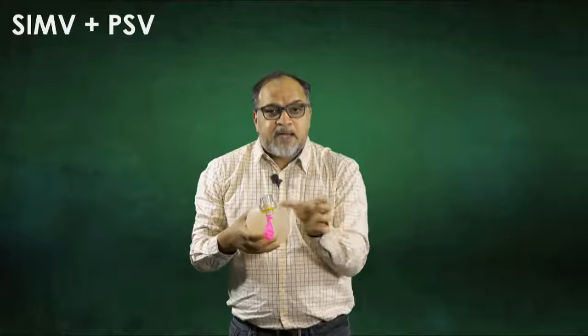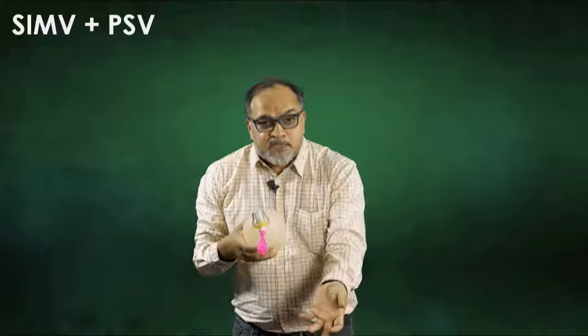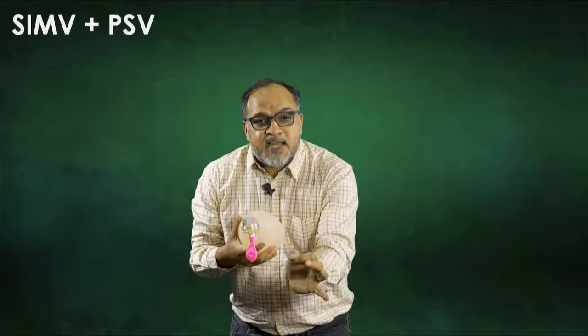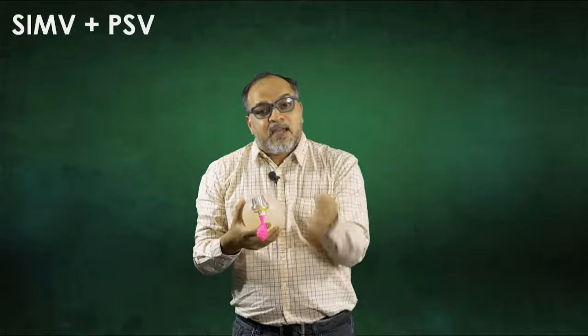So in between the mandatory breaths, it will act like PSV mode, and at the time of mandatory breaths, it will act like CMV mode. And what happens if the patient tries to breathe at the 6th second exactly? That time the ventilator will give the full tidal volume breath as if it was a mandatory breath.